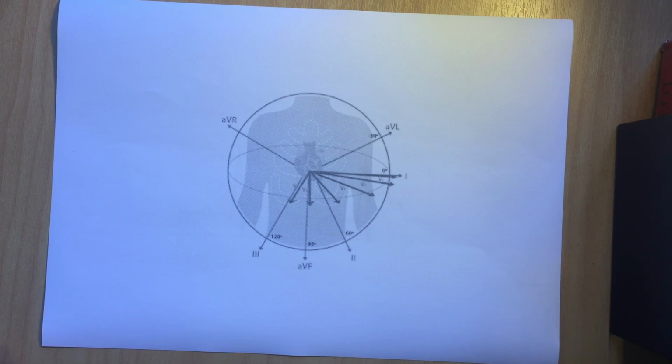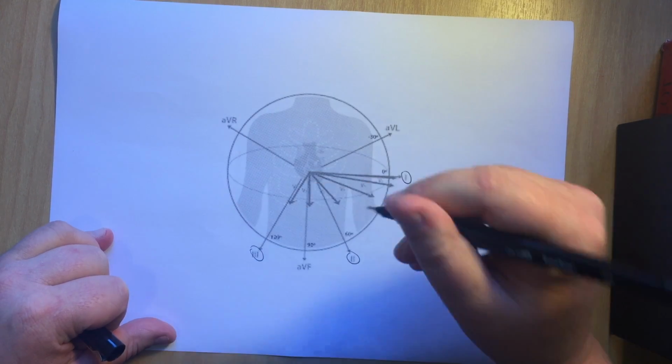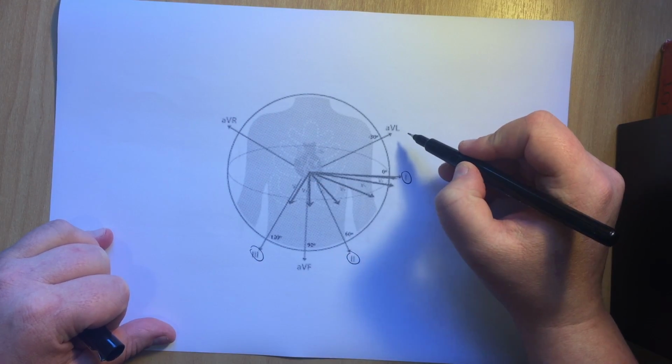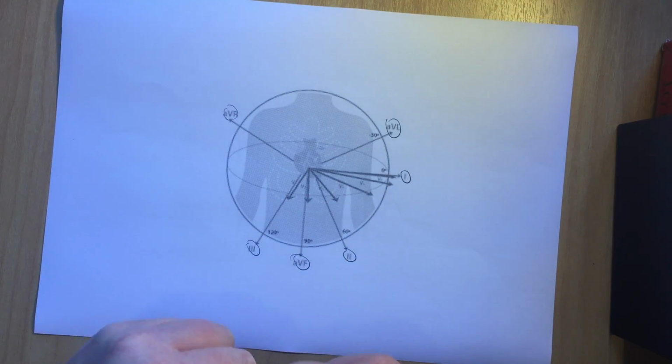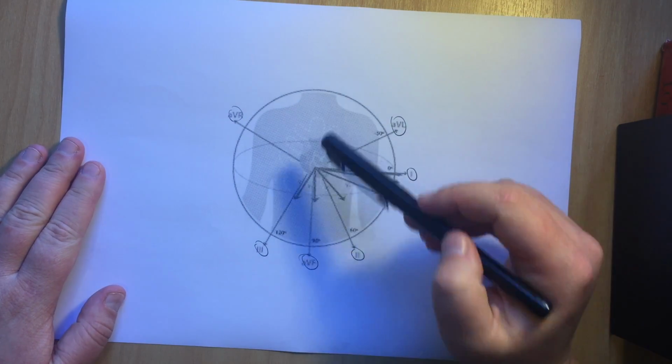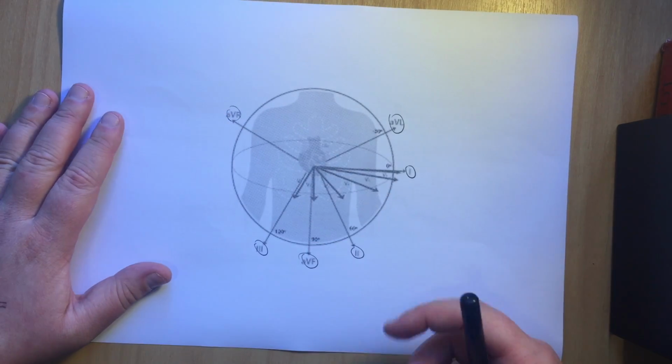And so we've got some leads that look at the electrical activity of the heart vertically or in the coronal or frontal plane. So those are our limb leads, which is 1, 2, 3. And then our augmented limb leads, AVR, AVL and AVF. So as you can kind of see on this diagram, all of those are looking at the heart in that vertical plane.